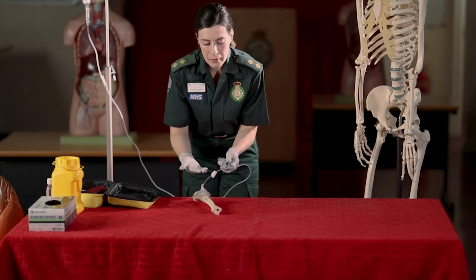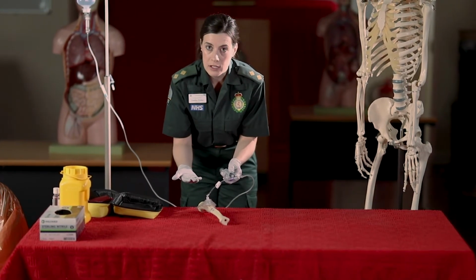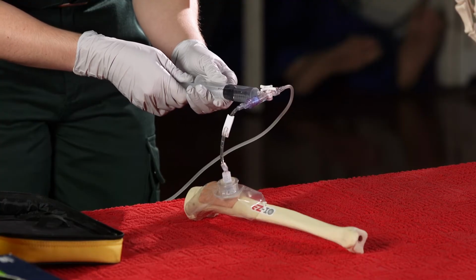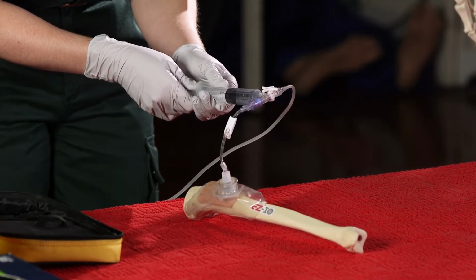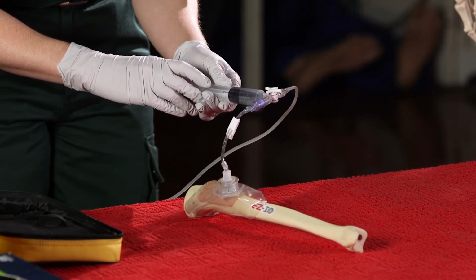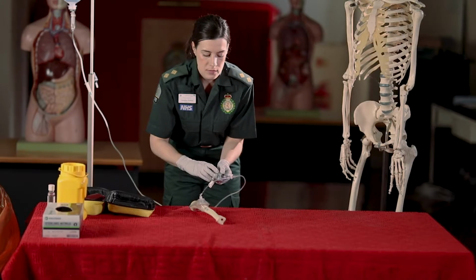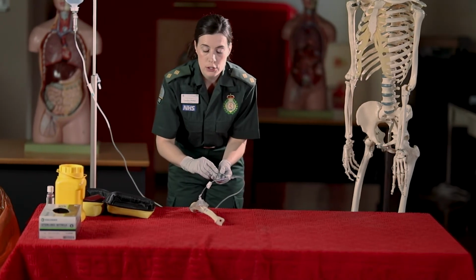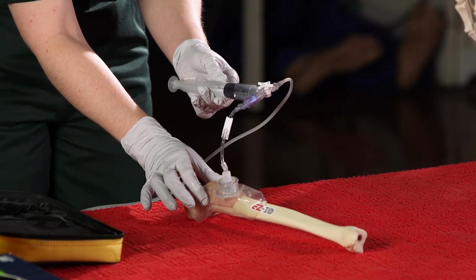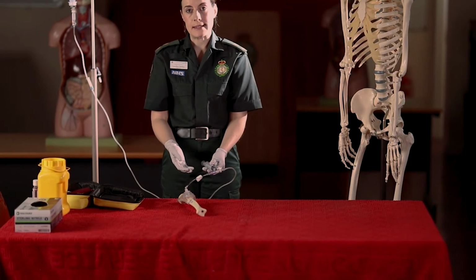If I don't get any bone marrow, I'm still going to attempt to flush the site, just being mindful that perhaps I haven't placed it properly. So I'm going to go ahead and flush my site with 10 mils of saline for an adult or 5 mils for a child. When I'm happy that that has flushed through, I've checked the site, there's no obvious tissuing or swelling, I can go ahead and use my EZ-IO port.